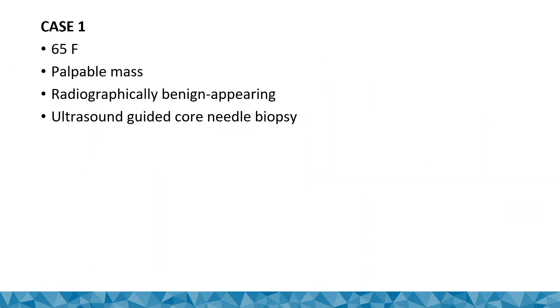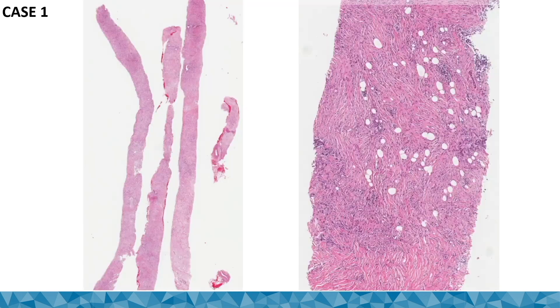Our first case is a 65-year-old woman with a palpable mass. It looks benign on radiology, but they recommend an ultrasound-guided core. Here's the core biopsy — low power on the left, higher to medium power on the right. What you can note is that there's really no benign breast tissue, but there does appear to be entrapped mammary adipose tissue.